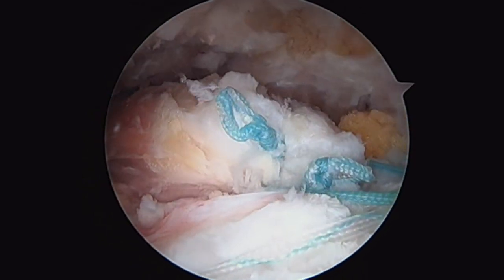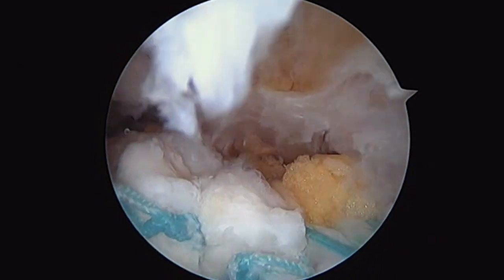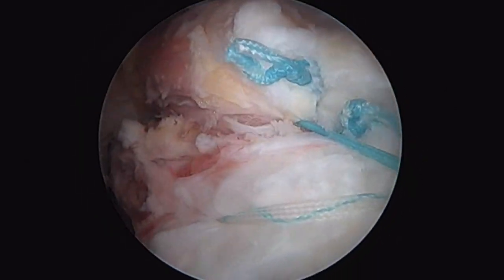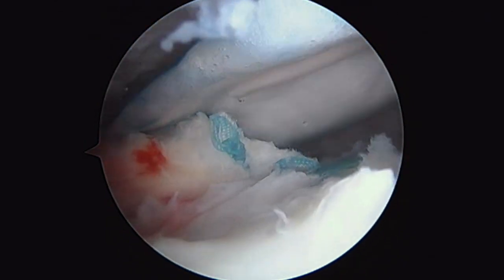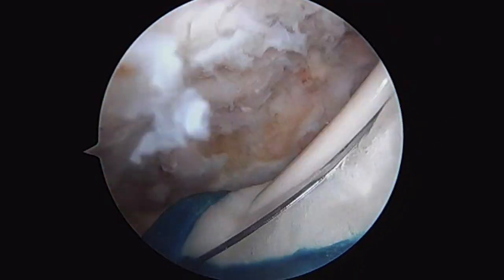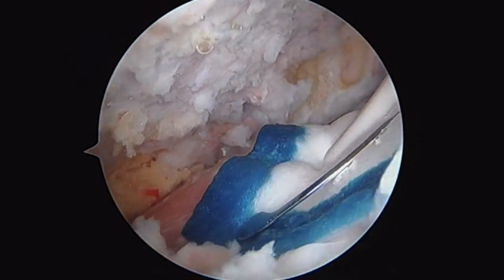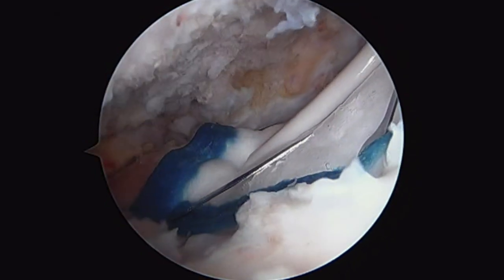Final look at our repair. You can see the two side-to-side sutures, posterior anchors brought up into that lateral row — humeral head covered. That looks pretty good. The final thing I'm going to do is give this a little bit of biology, laying this collagen patch over top of our repair tissue right about there at the junction between the tendon and the interface, just to give it a better chance of incorporating and healing. I think if we put that right there, it's got a good chance.